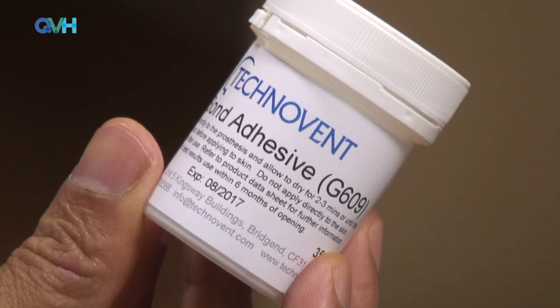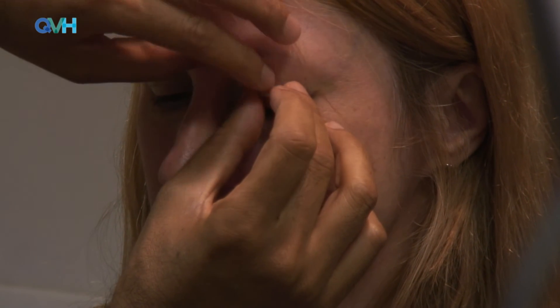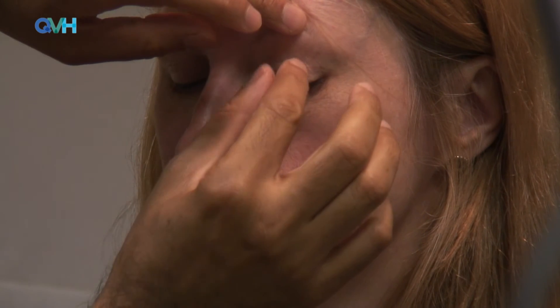Medical glue can be bought from any pharmacy or ordered over the internet. As you can see, a one gram external weight is being used with the double-sided tape that comes with the weight. The weight is placed in exactly the same position as the trial weight. The patient blinks and also gently closes their eyes and can wear this throughout the day and at night, particularly when using medical glue.